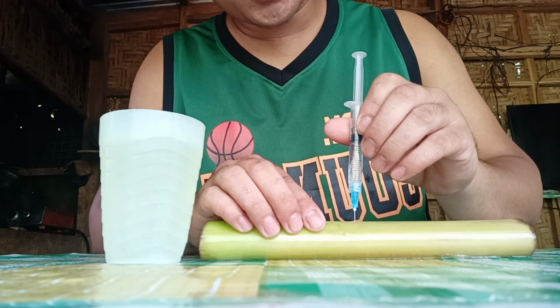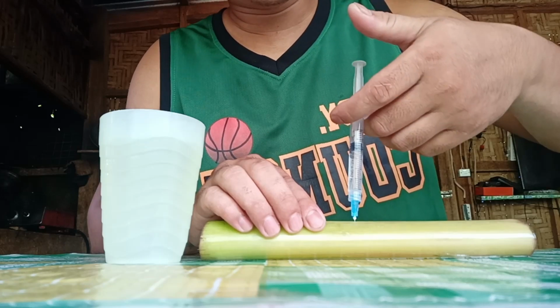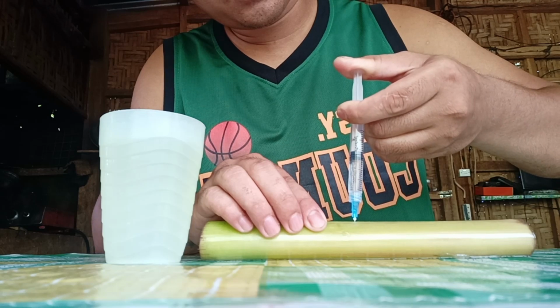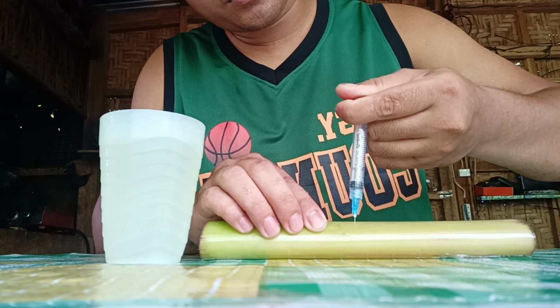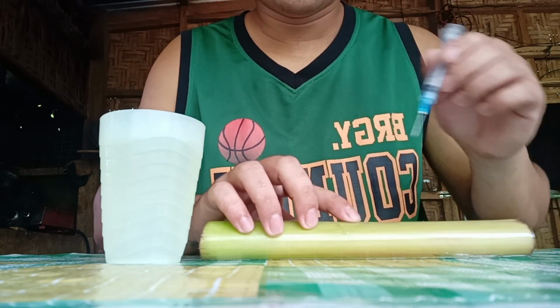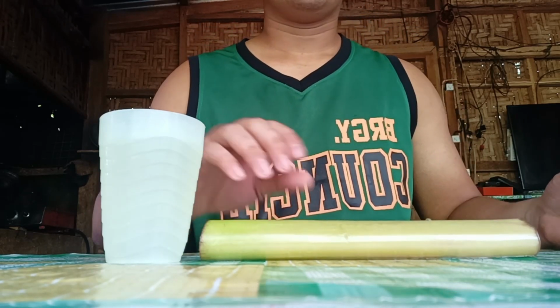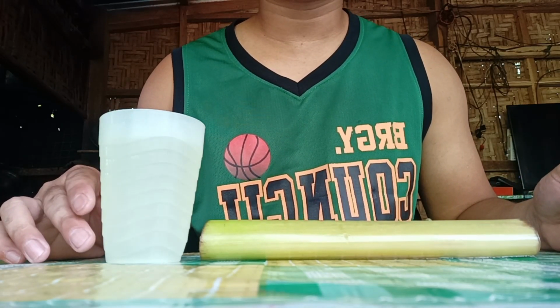Be sure to reach the muscle tissue of the animal, because that is the target of intramuscular injection. Massage after injection. And that is the intramuscular injection using the 90 degree angle.